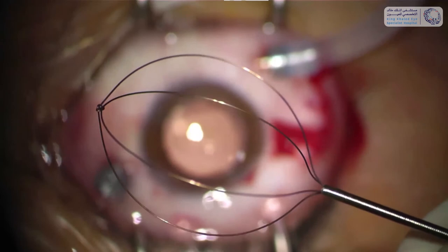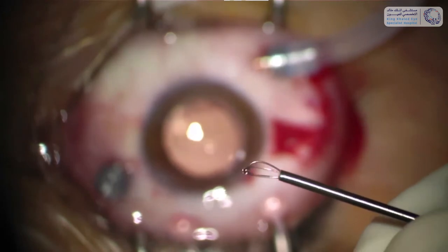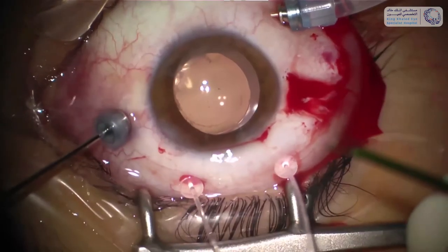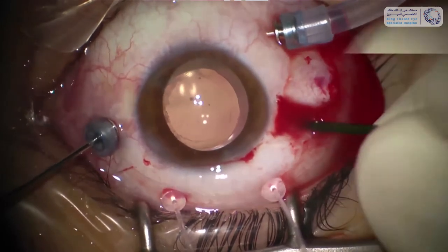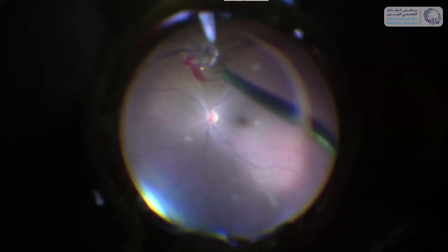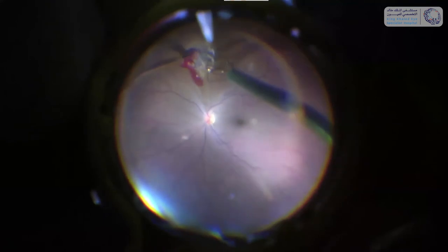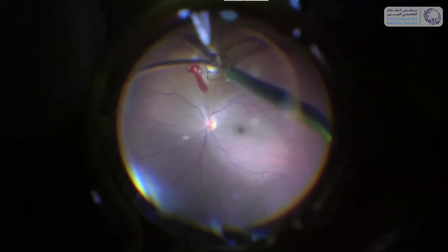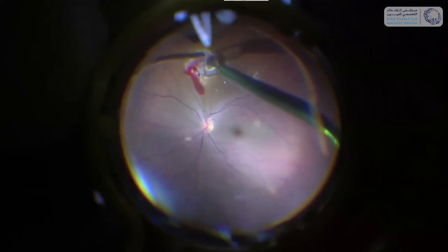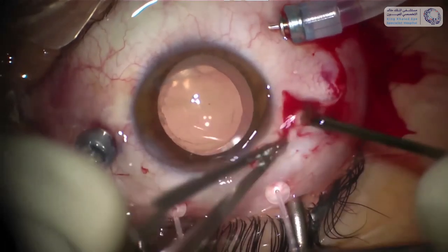For that purpose I used a kidney stone extractor — something which you can find in your renal department. It's a 20 gauge instrument, one meter long, but it doesn't matter — you can have it operated by your assistant. I'm holding it in my right hand, my assistant opens it slightly, I move the intraocular foreign body into the basket, and when it's in the basket I ask my assistant to close it. That way it is grasped very tight and you can remove it safely without it dropping back down on the retina.